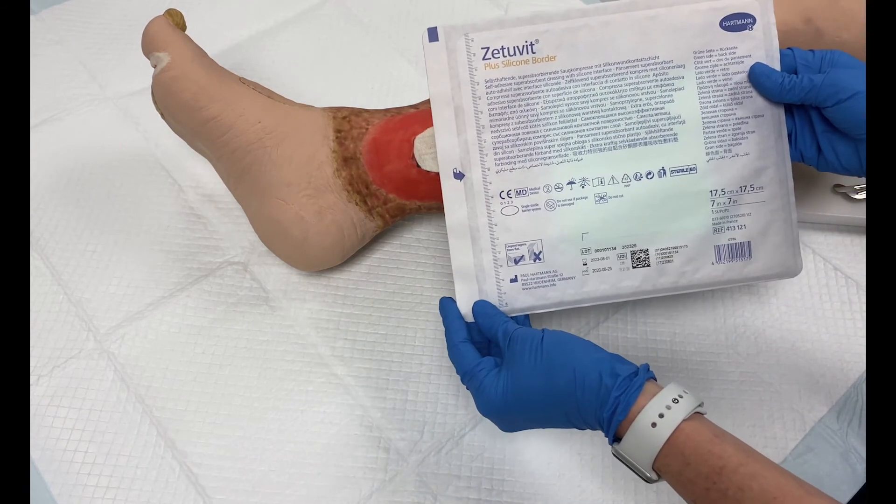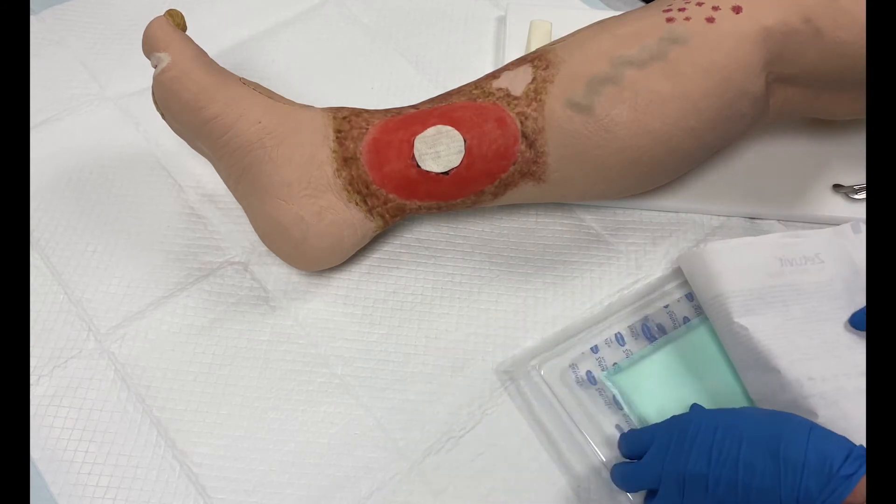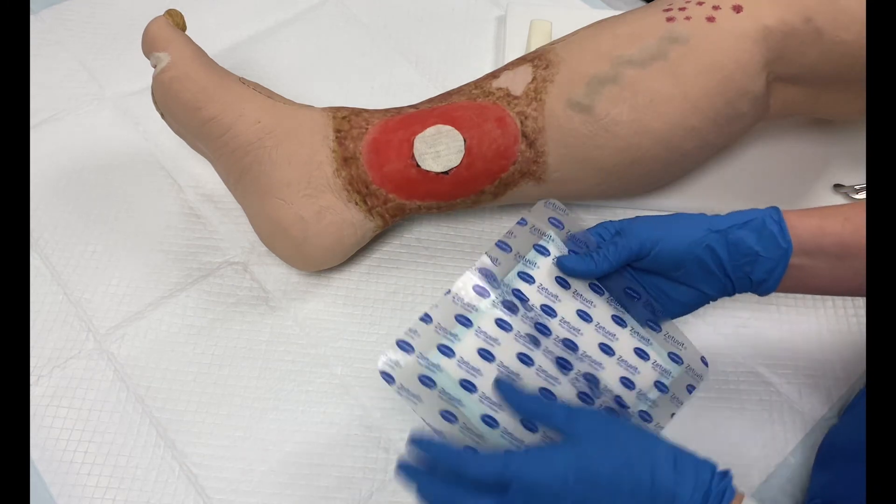Next, apply a Zetivit Plus silicone border. You should not cut the pad of the Zetivit Plus silicone border, but you may cut the border of the dressing to aid in application to concave areas.